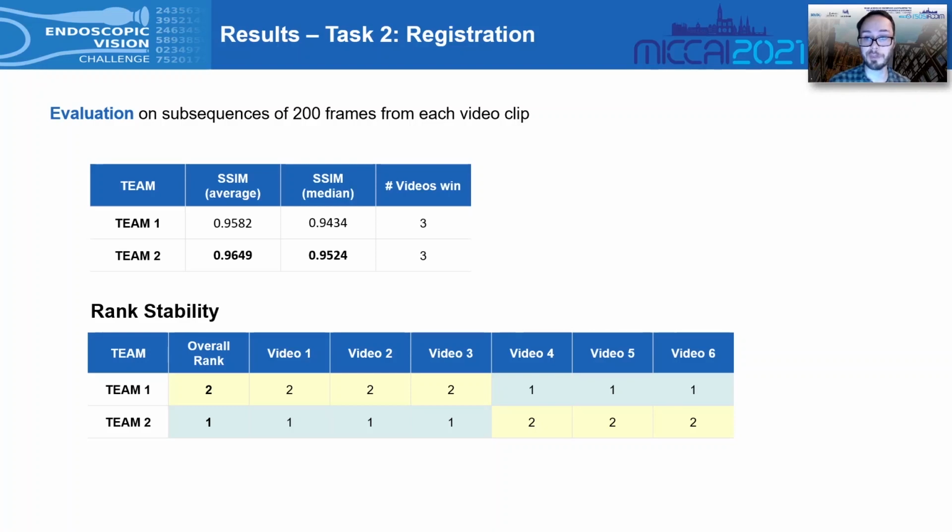So in more challenging videos where in some frames there are not enough features and the tracking fails, Team 2 produces much larger errors that completely destroy the subsequent mosaic. However, when there are different perspective warpings across the video, Team 1 is not able to model that successively. And in this case, Team 1 is worse than Team 2.